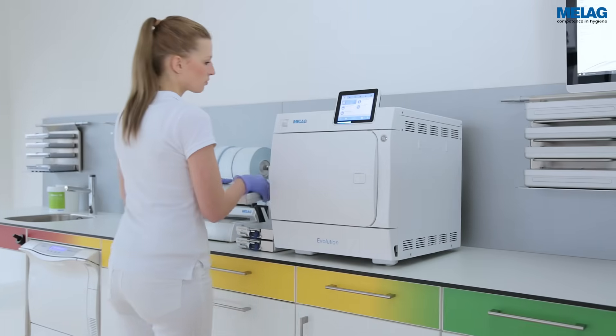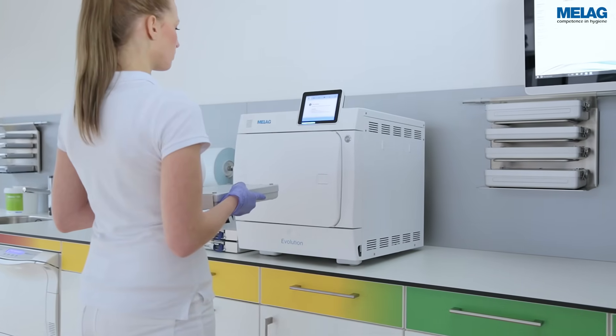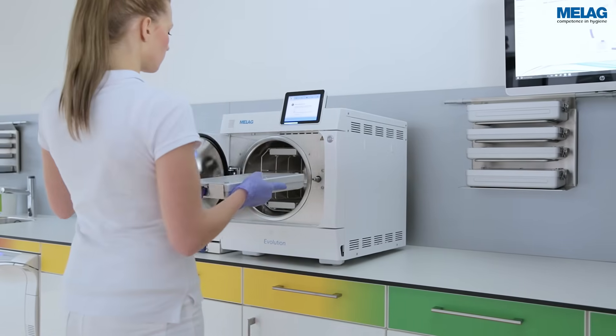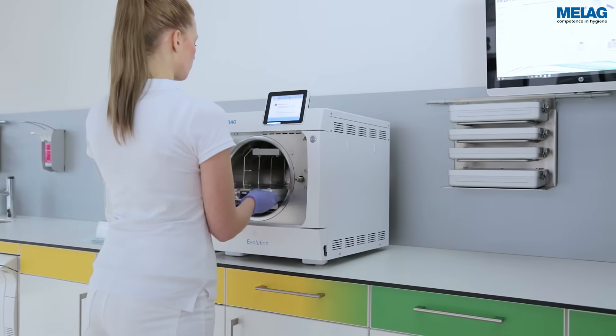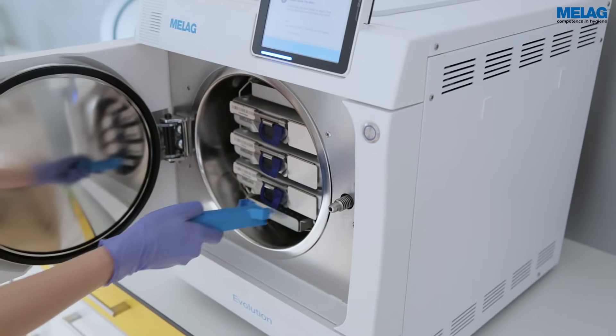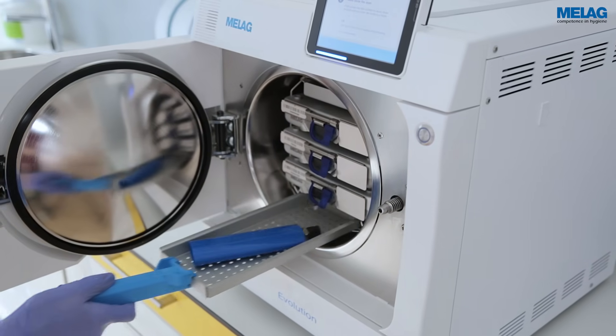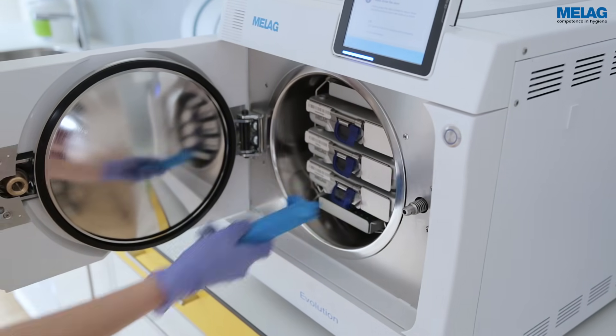The new Evolution Series tray mount enables effective use of the loading capacity of 9kg. In addition to the use of three MeLaStor boxes, individually wrapped instruments can be positioned on the trays. MeLaControl for batch approval can be easily integrated together with the load.